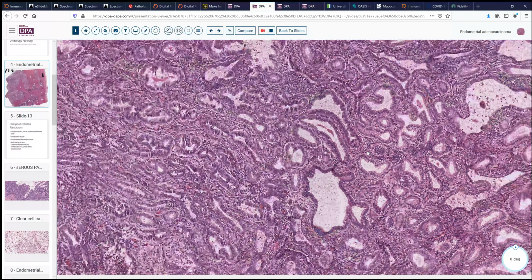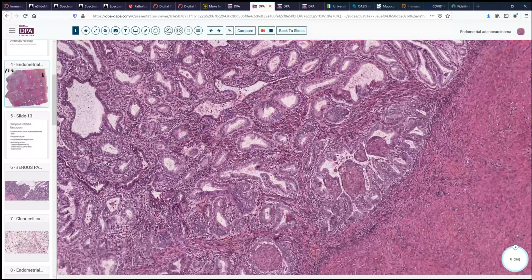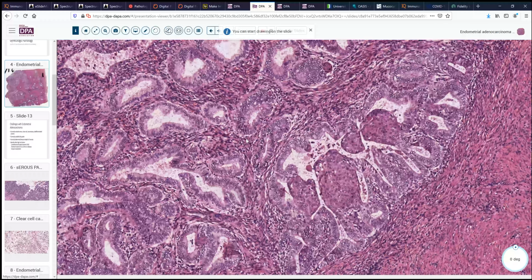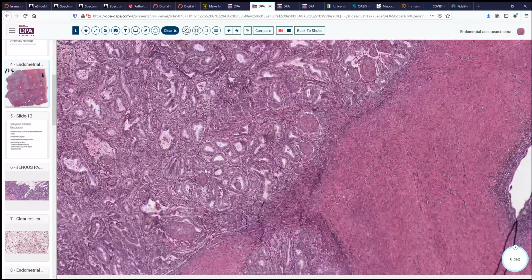So these are still fairly low-grade nuclei. The glands appear fairly low-grade without areas of solid tissue, save for perhaps right here we see an area where we have solid tissue in the lumen of this gland. And this represents squamous metaplasia or squamous differentiation in the tumor, which begins to form solid type tissue. We can see, however, that there is also some cribriform type formation with this glandular tissue. And here's more areas of this squamous differentiation as we look around.